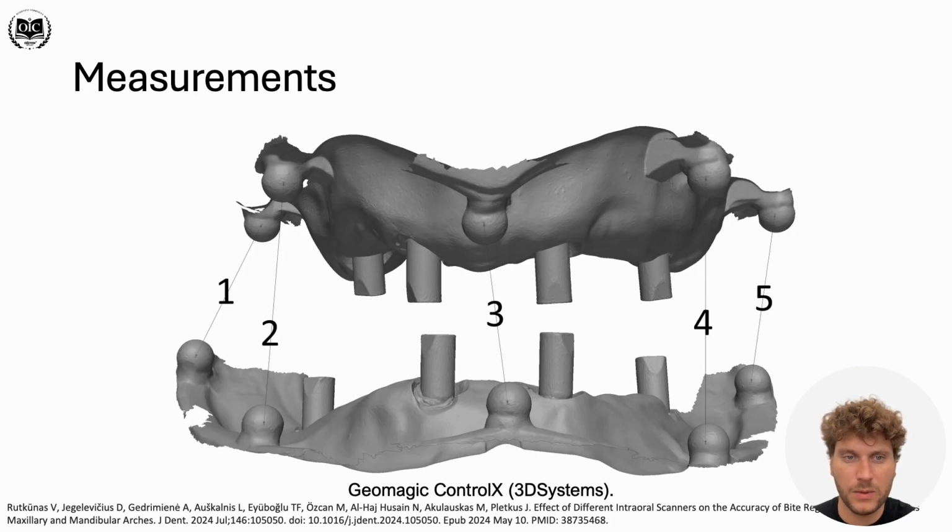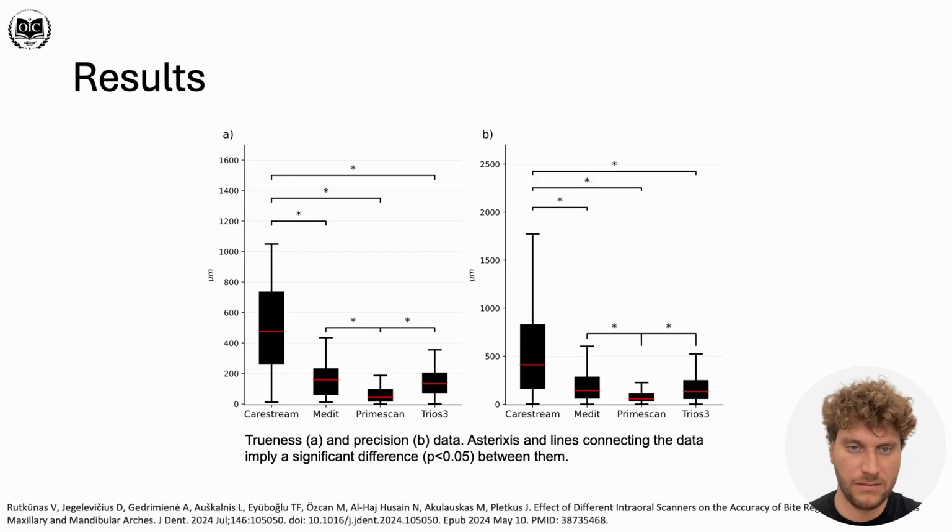Distances were measured between the corresponding metrological spheres, and then compared to the reference scanner measurements to get information on how much deviation is present in this in vitro environment.